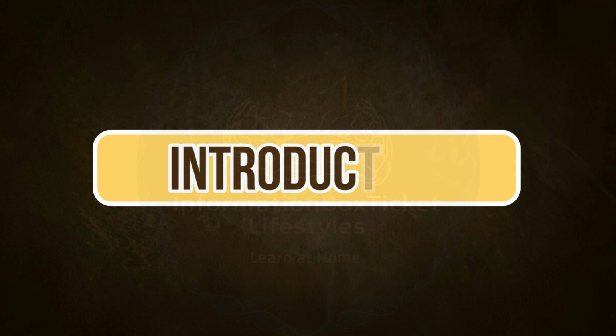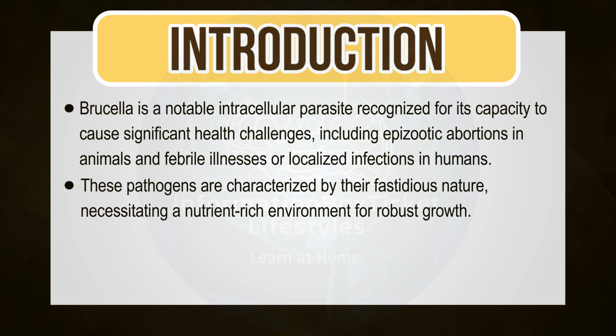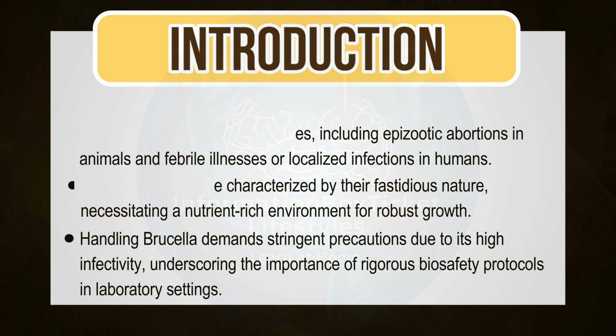Introduction to Brucella Agar. Brucella is a notable intracellular parasite recognized for its capacity to cause significant health challenges, including epizootic abortions in animals and febrile illnesses or localized infections in humans. These pathogens are characterized by their fastidious nature, necessitating a nutrient-rich environment for robust growth. Handling Brucella demands stringent precautions due to its high infectivity, underscoring the importance of rigorous biosafety protocols in laboratory settings.